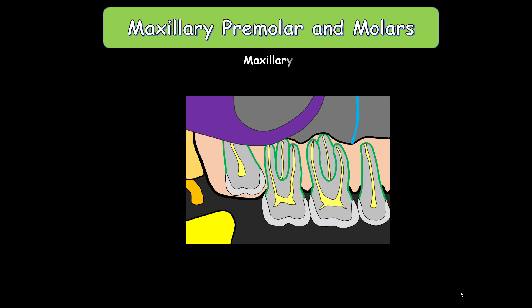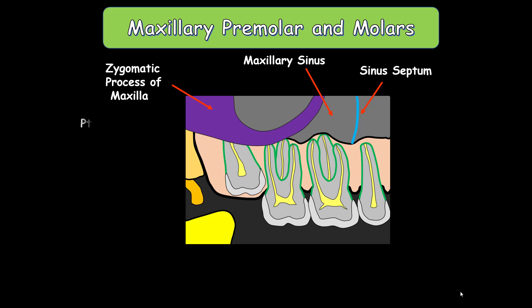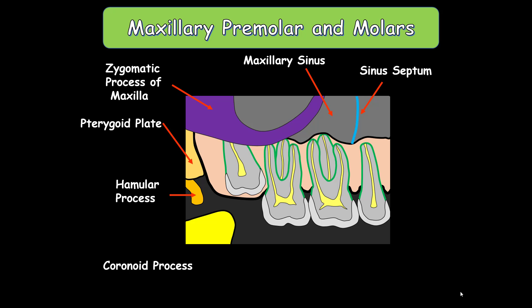So what landmarks do we see in this region? The maxillary sinus, the sinus septum, the zygomatic process of the maxillary bone, the pterygoid plates of the sphenoid bone, the hamular process, the coronoid process, and the maxillary tuberosity.